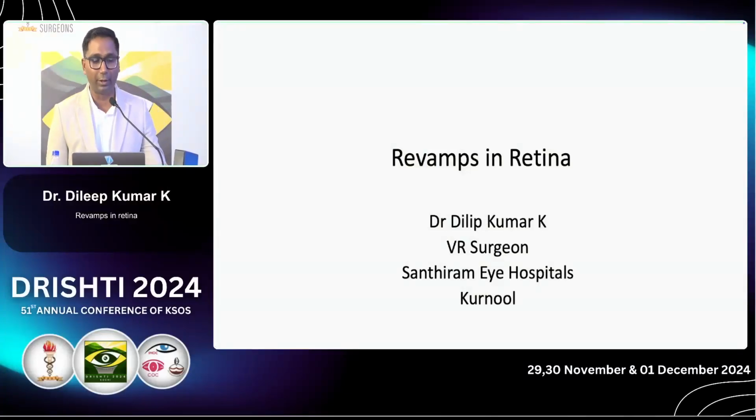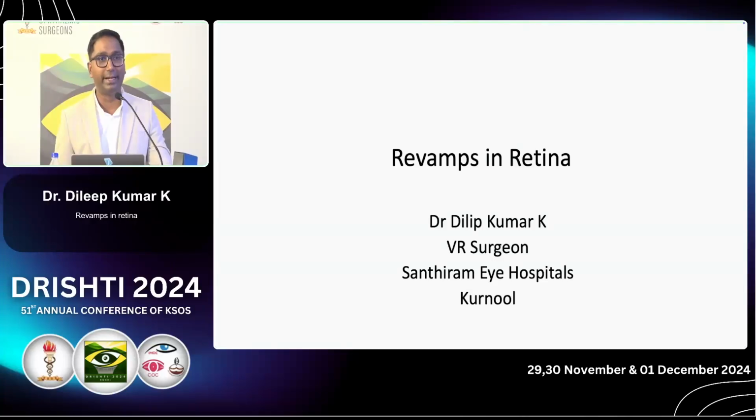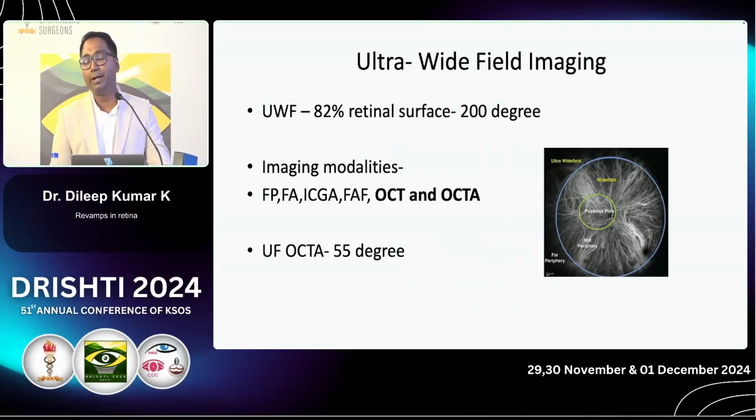Good afternoon, one and all. I will be talking to you about the recent updates in retina. So, ultra-wide field imaging. Any image beyond 50 degrees is termed wide field, and ultra-wide field captures up to 200 degrees. OCTA can capture up to 55 degrees.